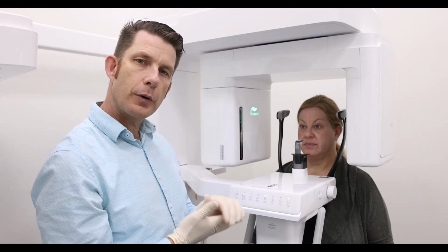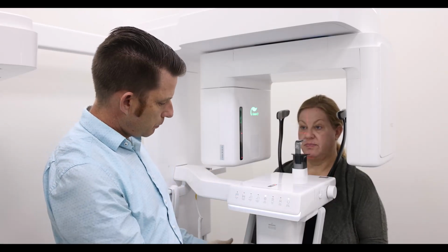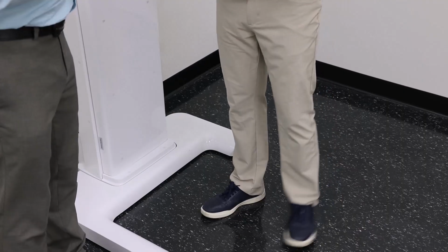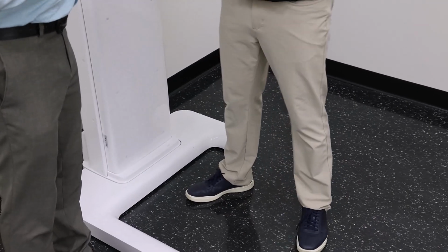Couple things to start with for patient positioning. I'm going to start with the hands. Go ahead and hands palm facing up. Go ahead and walk forward, feet shoulder length apart. Then I'm going to have the patient bite on the bite stick.